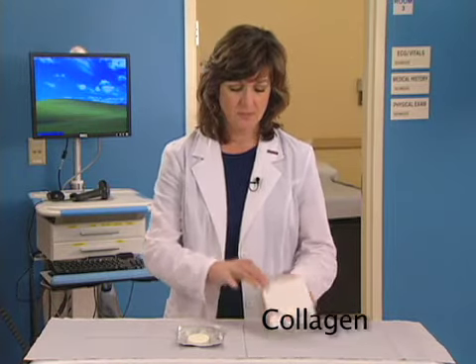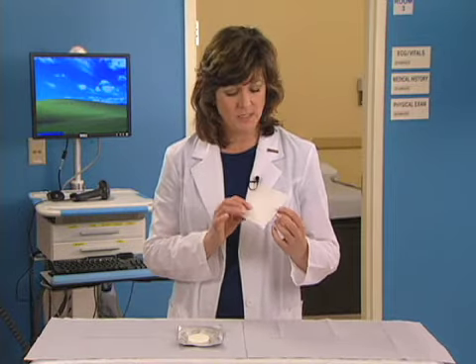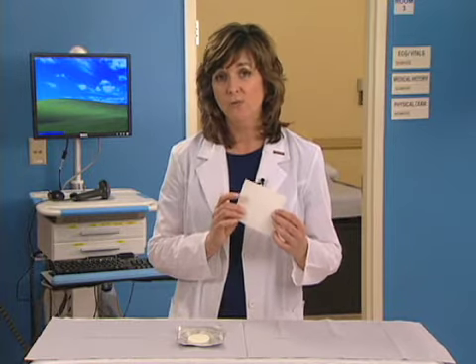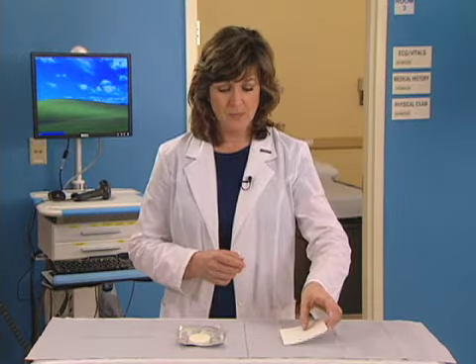Collagen dressings. These dressings positively enhance and influence wound healing, not only by encouraging the deposition and organization of newly formed tissue, but also by stimulating macrophages and fibroblasts. They are generally available in the form of sheets, gels, or particles, and can be moisturizing or absorptive, depending on the delivery system, to maintain moist wound healing. They are easy to apply and remove, and tend to be conformable.